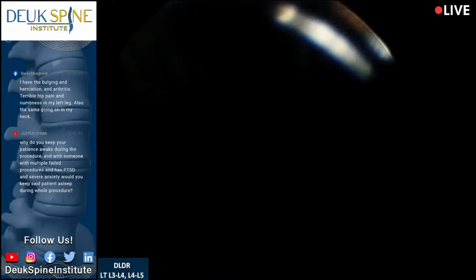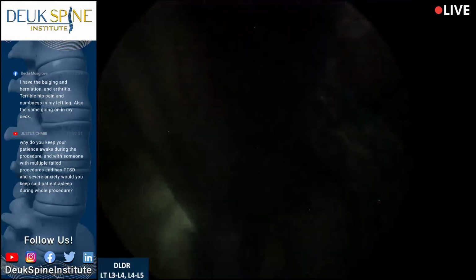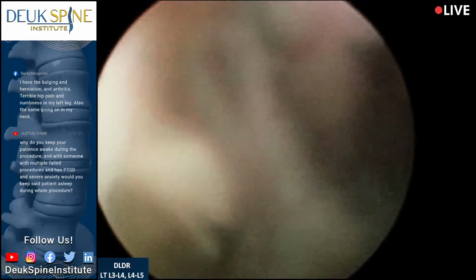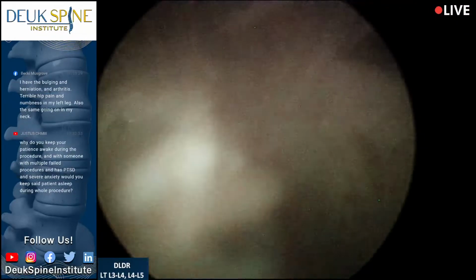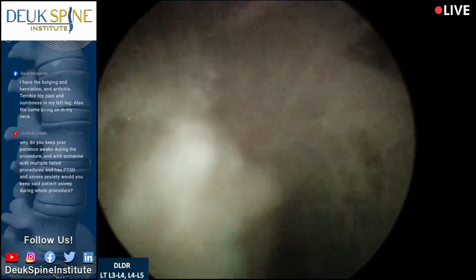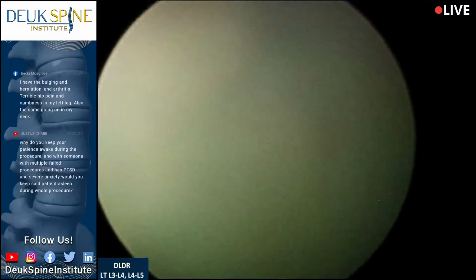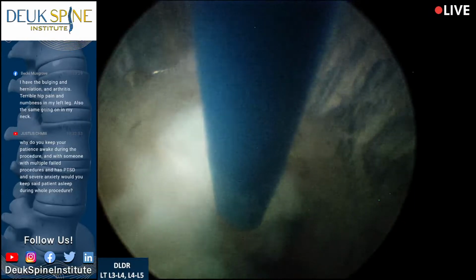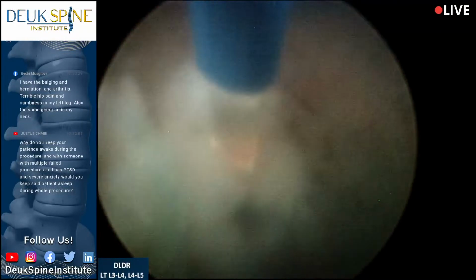We have a question. This comes from Justice on YouTube. Hi, Justice. Switching irrigation? All right. Thanks. And yes, Justice, they asked, why do you keep your patients awake during the procedure? And with someone with multiple failed procedures and has PTSD and severe anxiety, would you keep said patient asleep during the whole procedure?